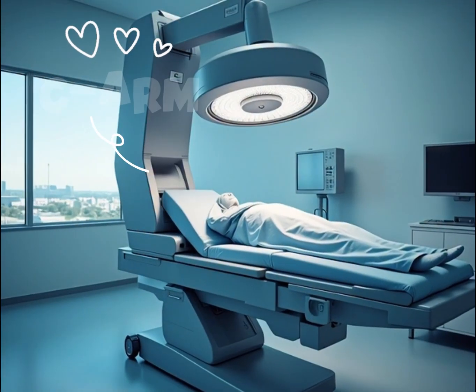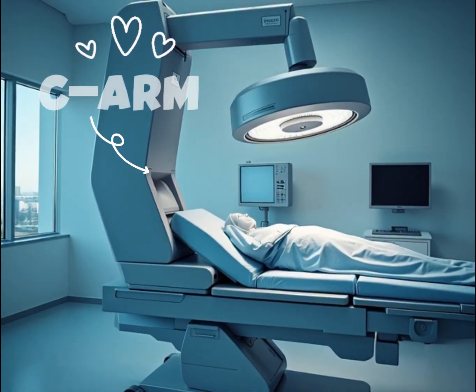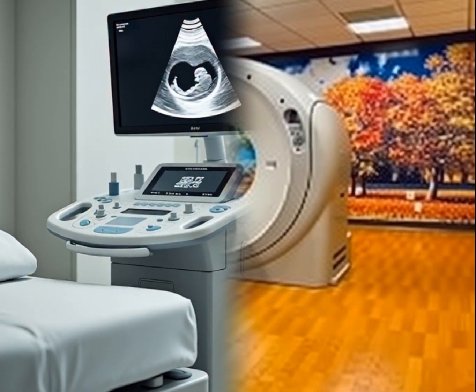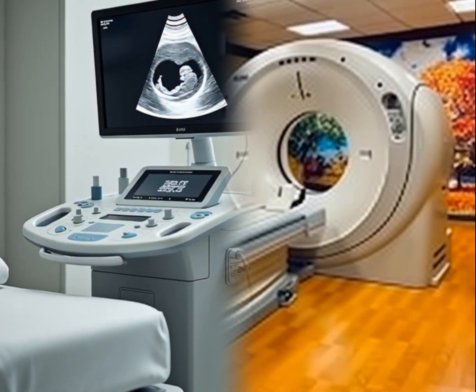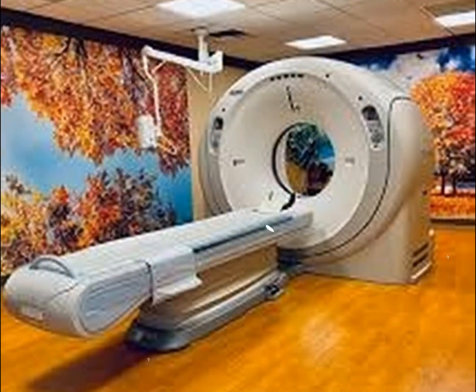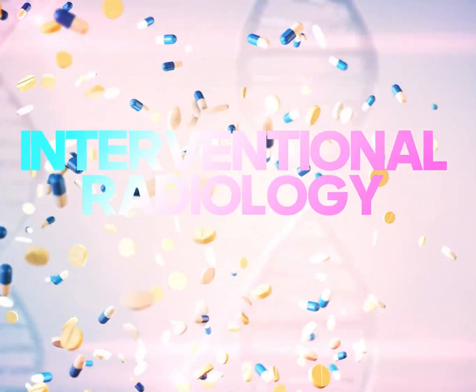The main imaging modality used is fluoroscopy, a real-time X-ray imaging technique that helps doctors see the movement of the catheter inside the blood vessels, as well as ultrasound, which is used to assess blood flow, and the CT scan or CT angiography, which is used to evaluate blocked arteries.